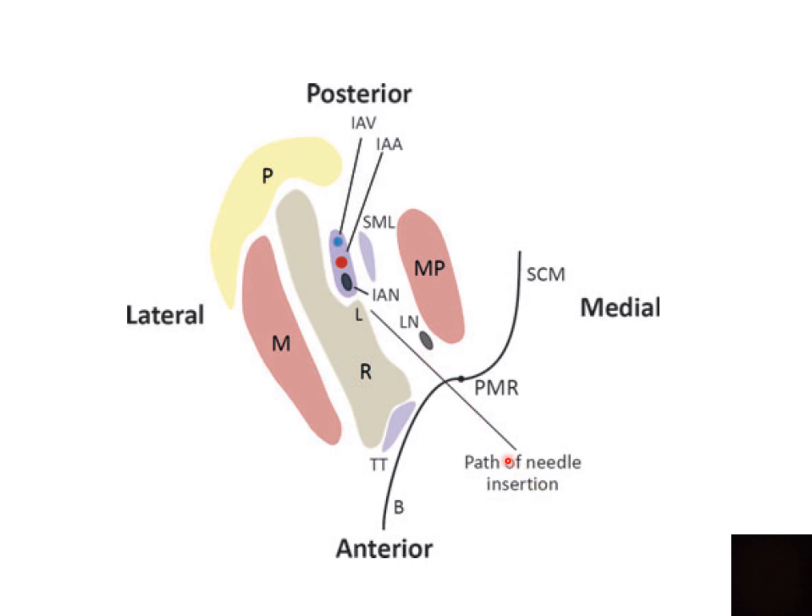So when you administer an inferior alveolar nerve block, because both nerves are contained within the same space, a single injection aimed at providing anesthesia for the inferior alveolar nerve would simultaneously anesthetize the lingual nerve, and contrary to the old belief, you do not need a separate lingual nerve block. So these are some of the important landmarks which you must bear in mind when you consider the technique for an inferior alveolar nerve block.